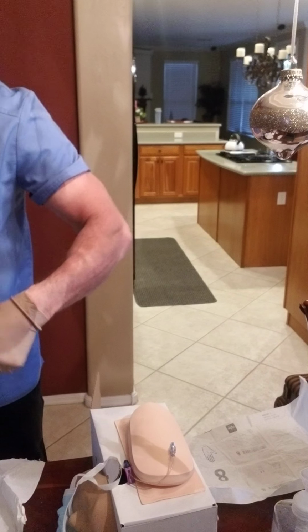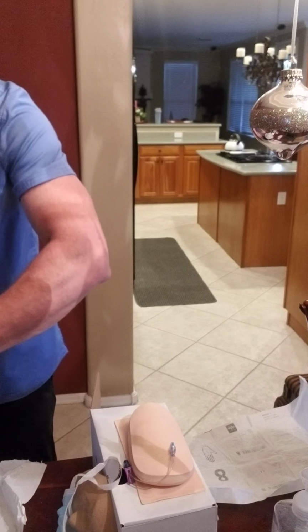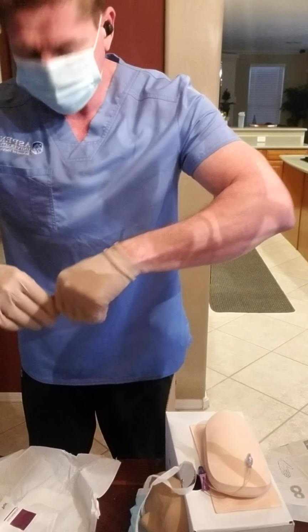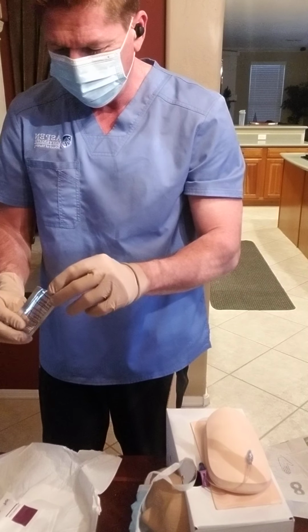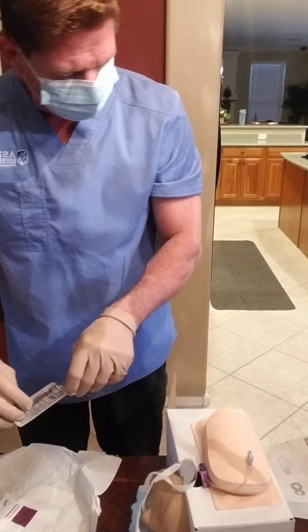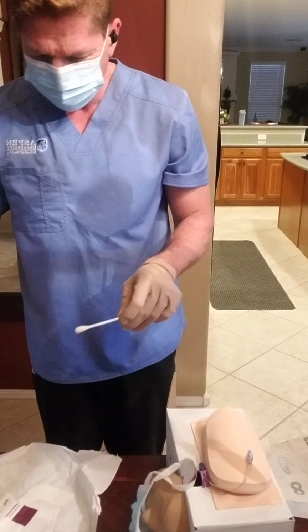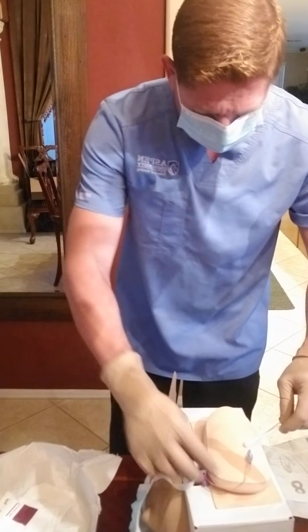Now I need to turn the camera towards me, but I just wanna let you know that if I was to do that, it was gonna break sterility, and I wouldn't have a camera while doing this process. I just wanted to show you the process I use to do my gloves. I have a sterile field. I'm not crossing the sterile field. I'm just dropping that. So I'm gonna go ahead and start cleaning.